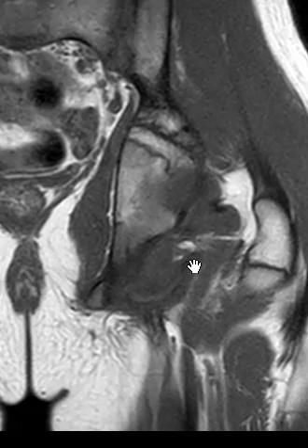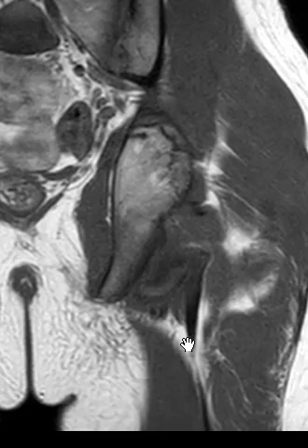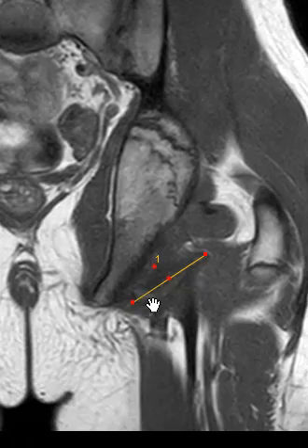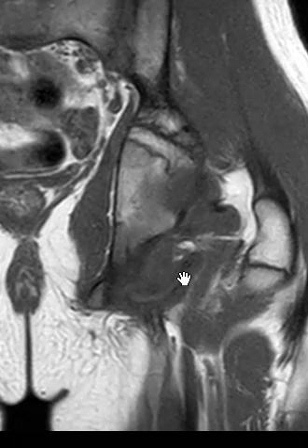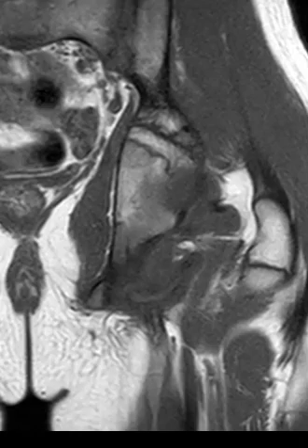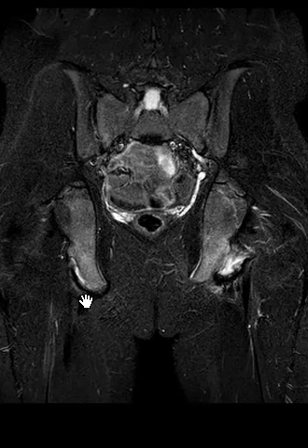On the coronal T1, this subtle area here is the apophysis — you can see the tendons come up and attach on this fragment, and here's the ischium over here. So this fragment, instead of going distally like we usually see, is distracted laterally.